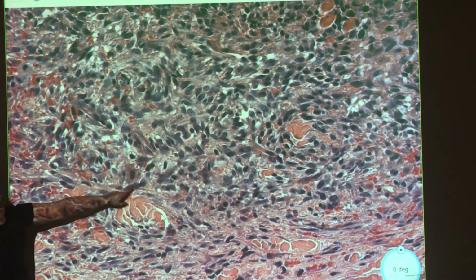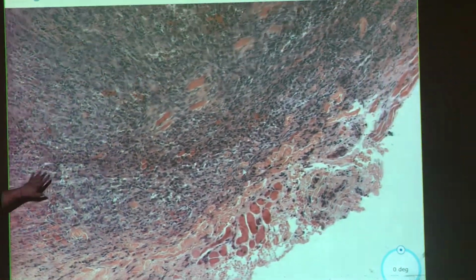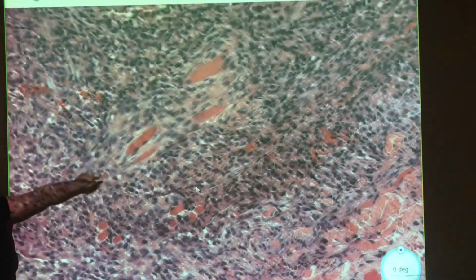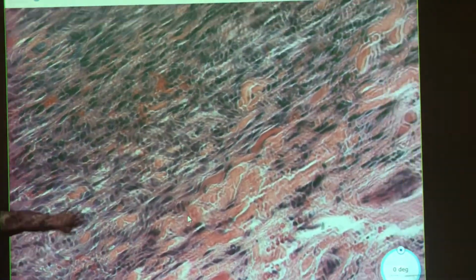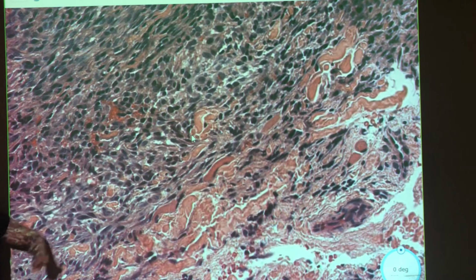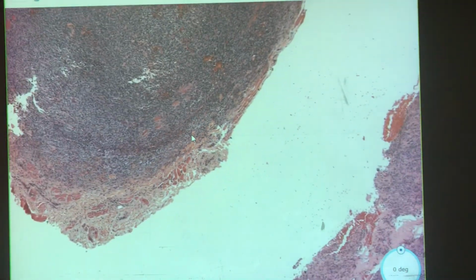And what do we notice with the lesion? Wrapping around it. So that's when we refer to trapping collagen. Maybe that's just some fibrin, some serum. But here we have collagen trapping, which is usually like a buzzword for this lesion. Along with the irregular borders.